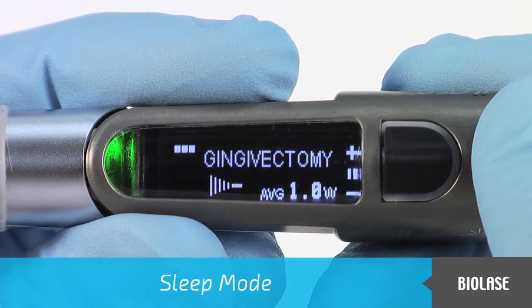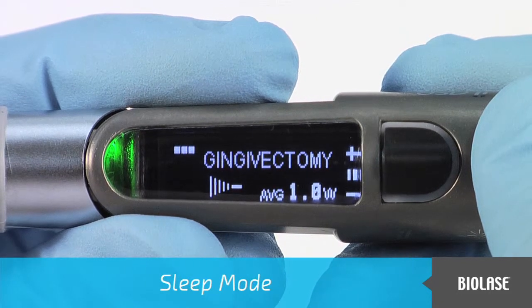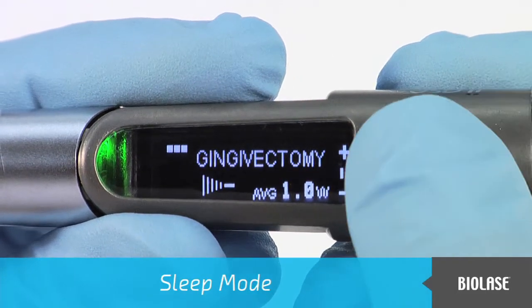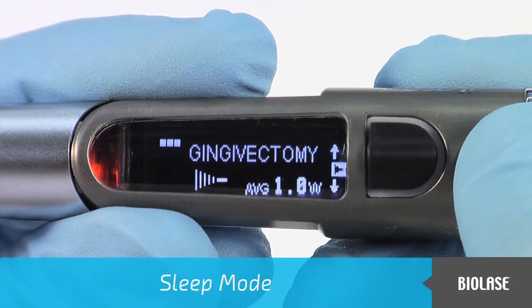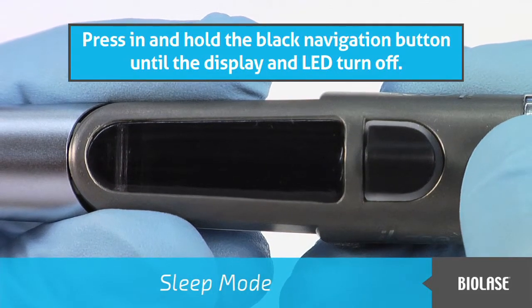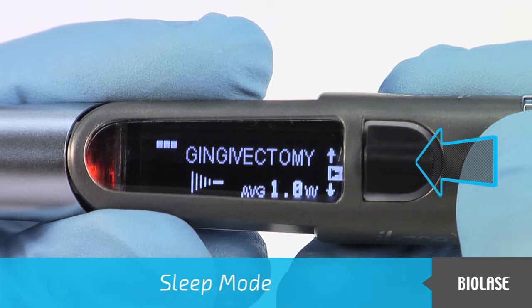Sleep mode conserves battery power by turning off the interface display and LED, and it also prevents laser activation. To enter sleep mode, first place the iLase into standby mode, as indicated by the orange LED. Then press in and hold the black navigation button until the display and LED turn off. To go back into standby mode, simply press in the navigation button.